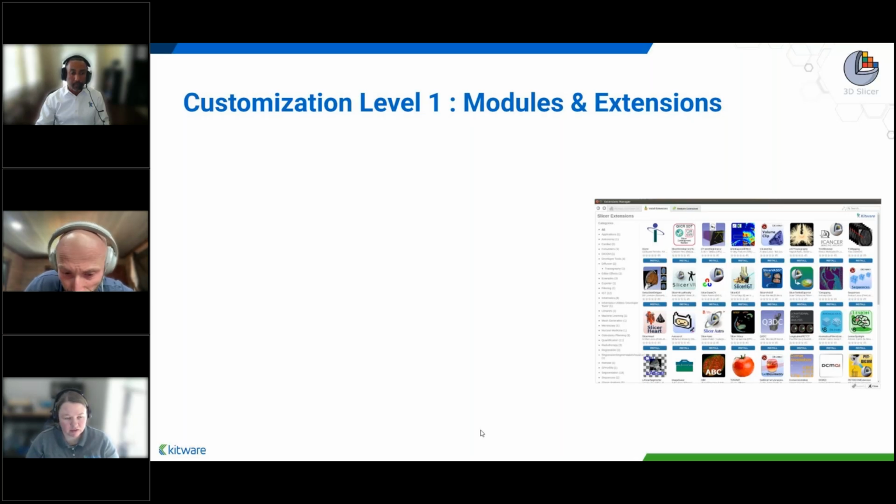But it is the active guiding principle of new development that we are doing in the 3D Slicer code base, that everything we want to do is being pushed towards making sure that we're able to make it a more modular tool, and therefore we can plug it into a different UI, a web backend, a web front end. And so that's all part of this modularization push.